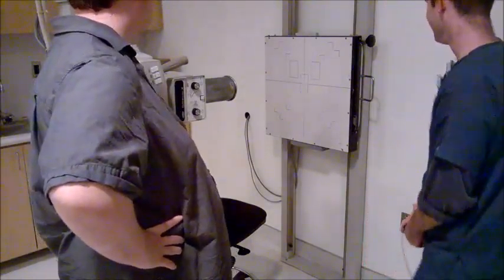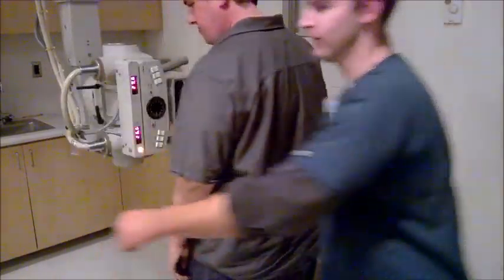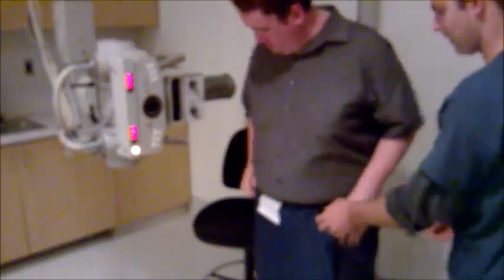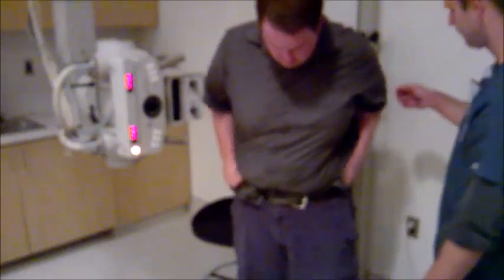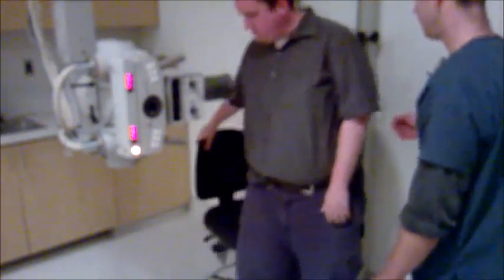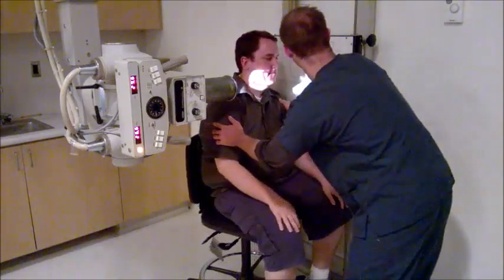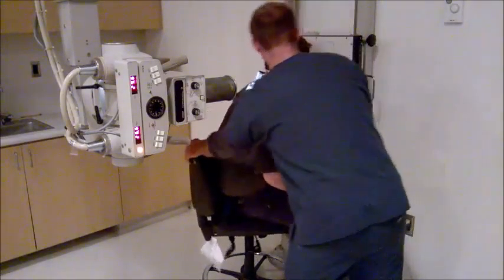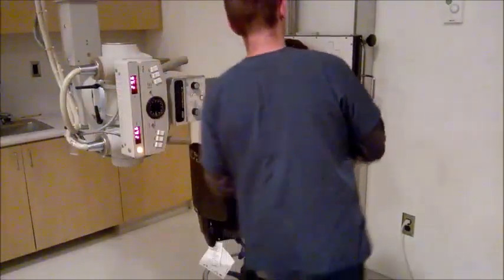Oh, okay. Well, we'll get you in this seat right here right after we put a lead on you. There we go, sir. And now bring it around the back, actually. There we go. All right, sir, watch out for the tube. There we go. All right, put your forehead and nose against the board right there. There we go.